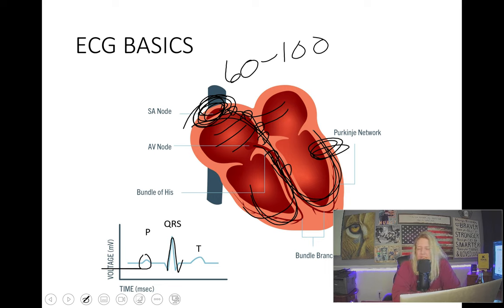They're not sinus beats. And look how wide they are from the beginning of the QRS to the end of the QRS over here. It's like 4.5 to 5 boxes, so this is almost 0.20, maybe 0.18 to 0.20. So you have a wide QRS with no P wave, a wide QRS with no P wave, a wide QRS with no P wave, and then we go back to an upright P wave and narrow QRS.